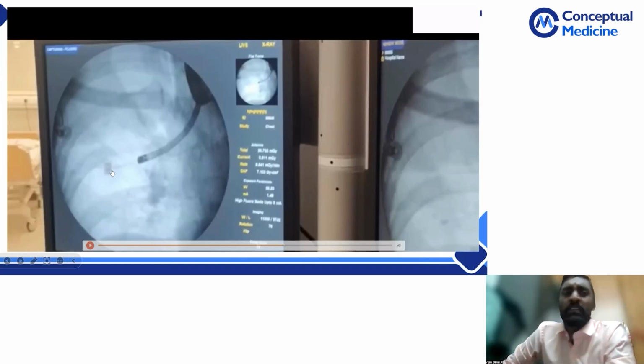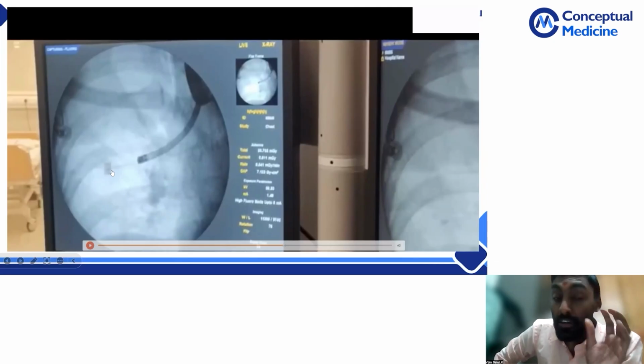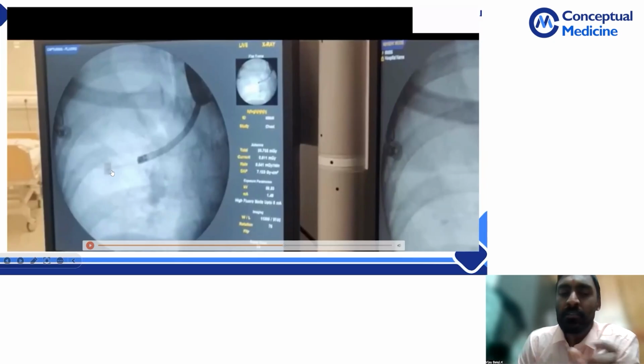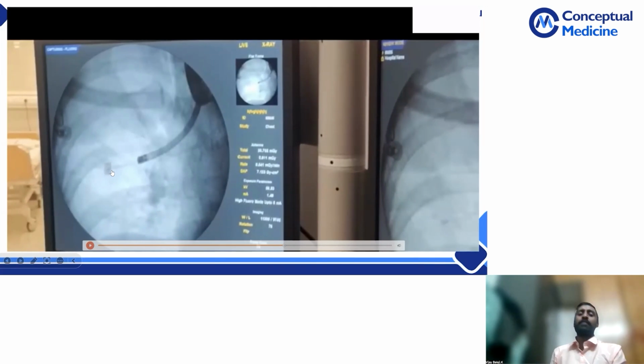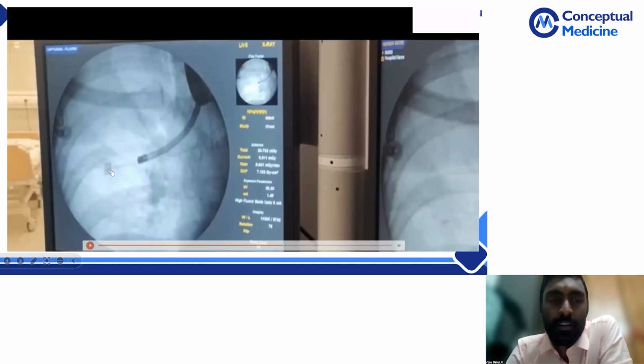So cryo probe means, like the name suggests, it is cryo. That means it will freeze the tissue. Because it is freezing the tissue, the advantage is it will preserve the architecture. So you will not have any crush artifact. And if you are using a cryo probe, the sample will be a very big tissue. So you can use advanced testing as well on that. And the larger the tissue, you will feel more confident with the diagnosis. Okay, so that is why people use a cryo.